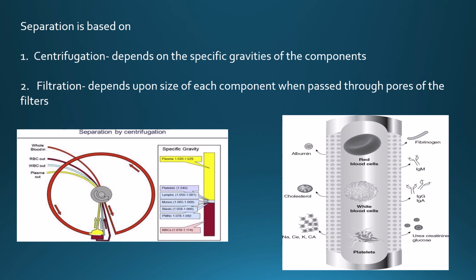Whereas in filtration, blood passes through a semi-permeable filter and smaller molecules like antibodies and toxins are removed, while larger components are returned to the patient. Once the target component is removed, the remaining blood is combined and safely returned to the patient, all in a continuous cycle. So based on the indication, we may remove the plasma, known as plasmapheresis, red cells, white cells, or even platelets. The beauty of apheresis is the precision. We only take the harmful substance and give the rest right back.